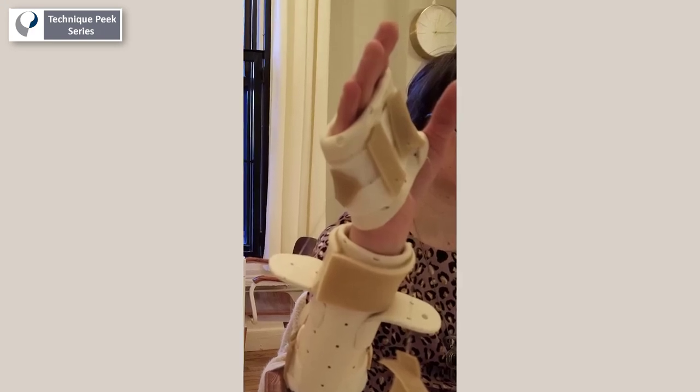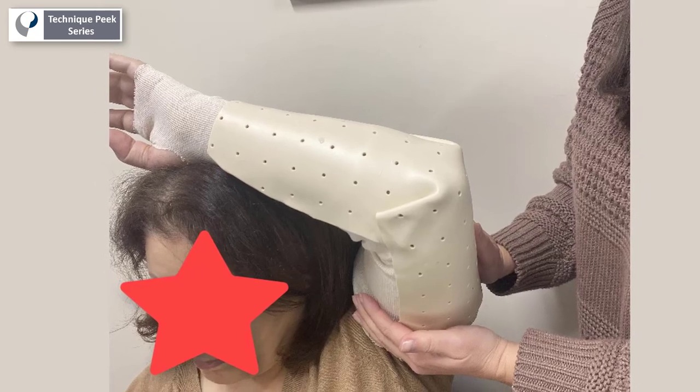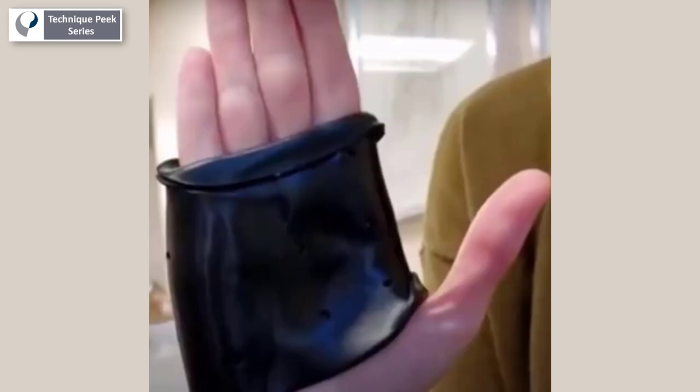Today we're going to see how to make the static progressive wrist extension and flexion splint. The two components needed for this splint are a posterior elbow splint and an MCP joint blocking splint. Those pieces will be connected dynamically to increase wrist range of motion.